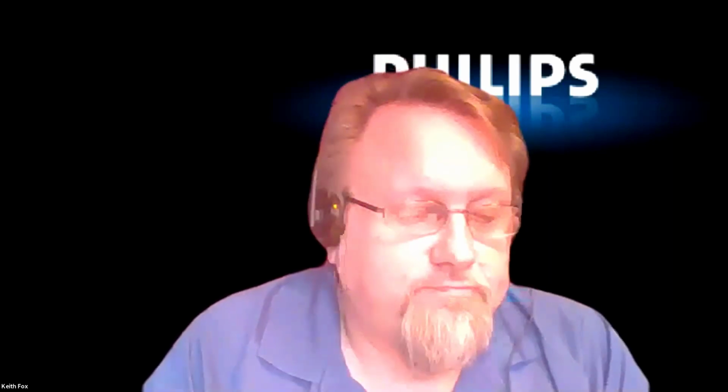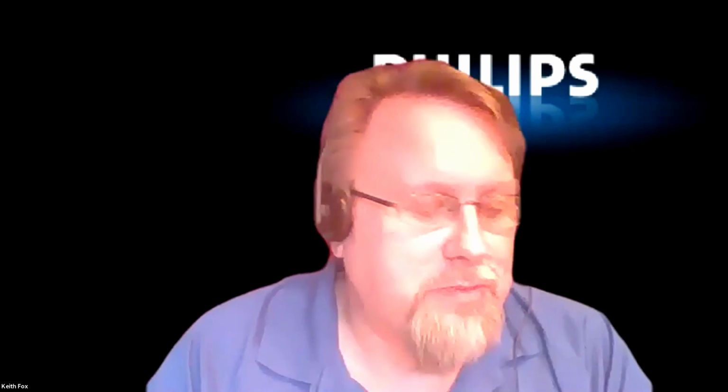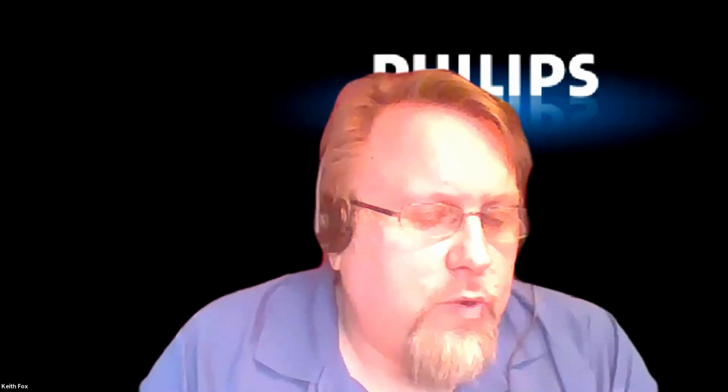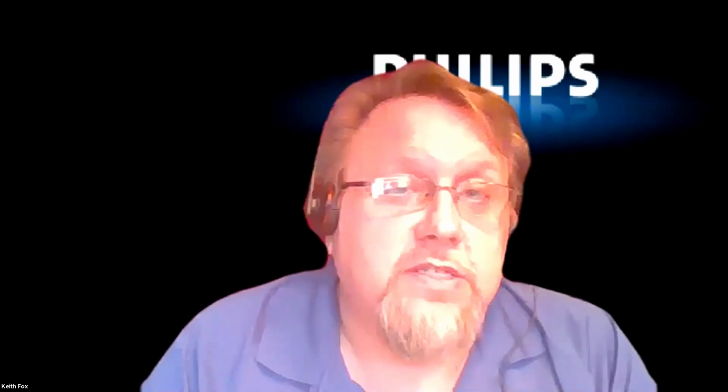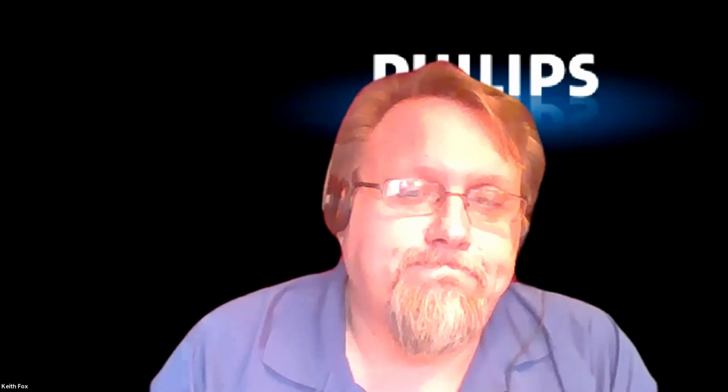So we do have some questions that I've pulled out of the chat box here. And I think there's probably some more rolling in, but I'll cover the ones I wrote down that were back in the buffer a little bit. Rick, what do you feel is the value of RV systolic pressure when doing these myocarditis assessments?